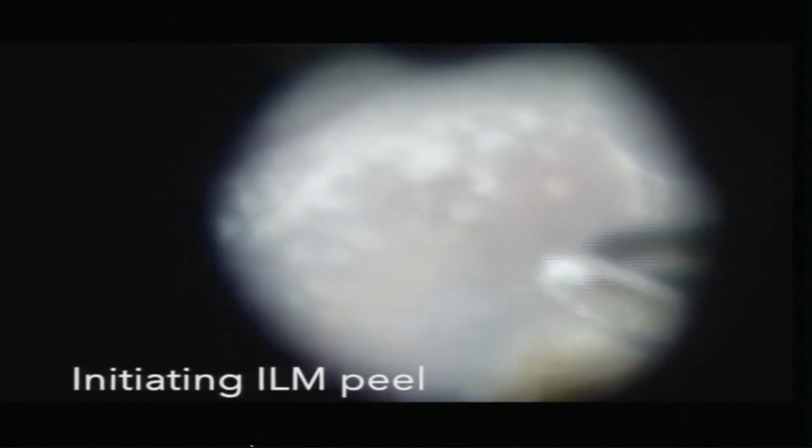So we try to do an ILM peeling, and along with the ILM peel, you can de-roof that small thin area without rupturing the cyst. The other added advantage is if it develops into a hole, we've already peeled the ILM, so it serves as a macular hole surgery also.